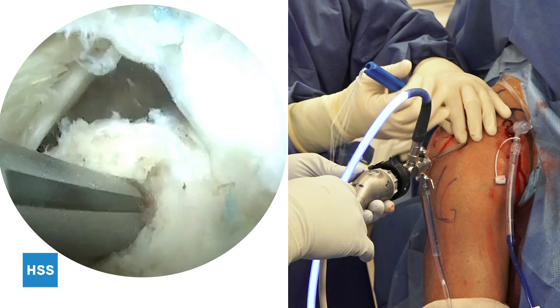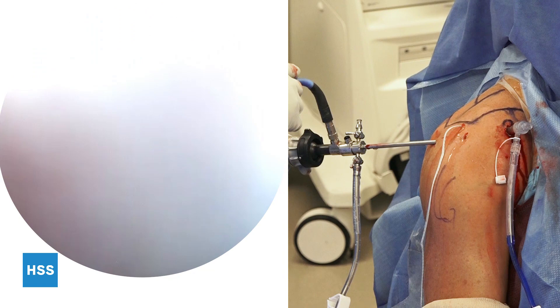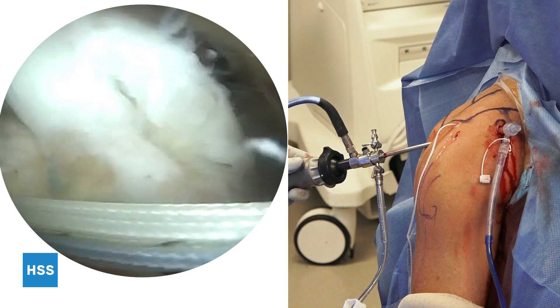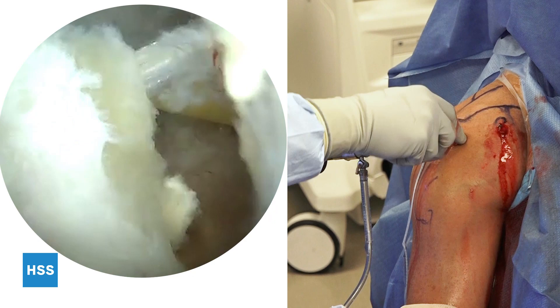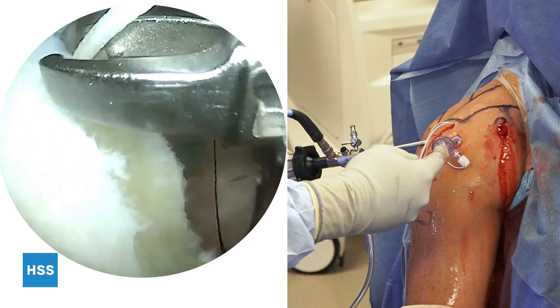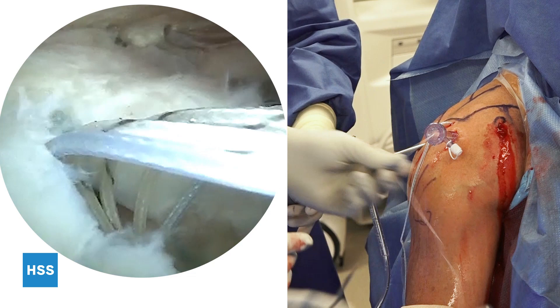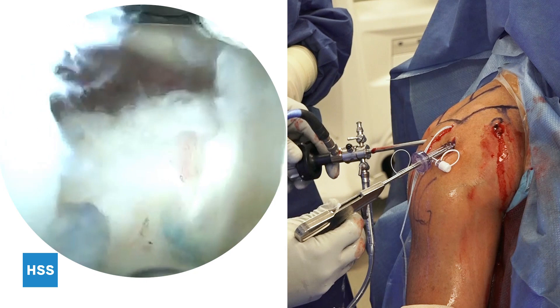Once the anchor is placed, I switch my camera to the posterolateral portal. Some external rotation of the arm brings the surgical field into view. The lateral gutter bursa is then debrided with a 4.0 shaver. A twist-in working cannula — 8.5 millimeters in diameter — is placed. We then start passing the sutures from anterior to posterior, which is my typical workflow. This is a self-suturing device. Care is taken to ensure that we are above the long head of the biceps tendon and not incarcerating it into the repair.